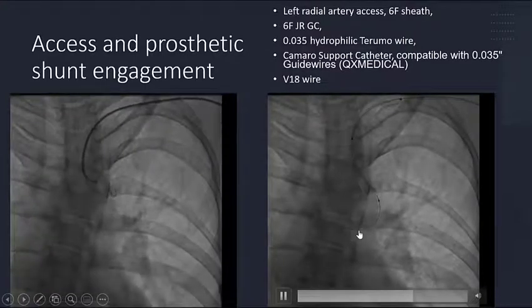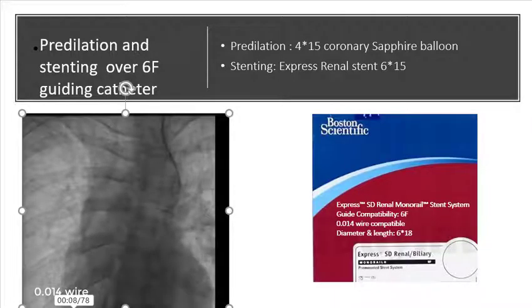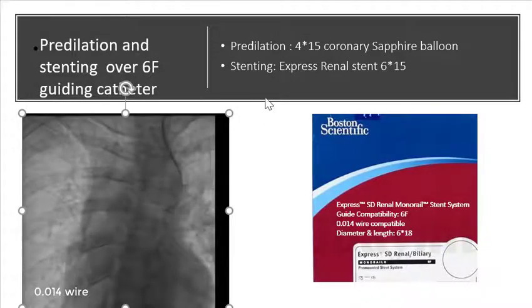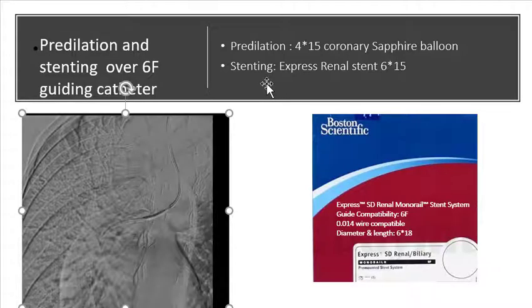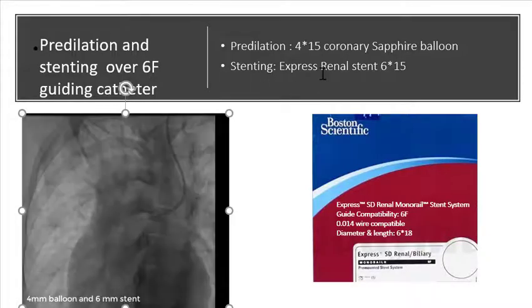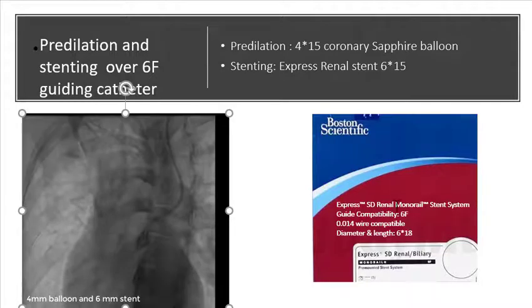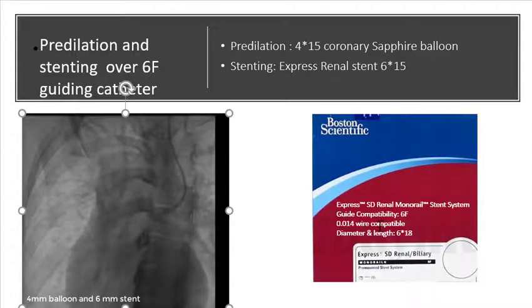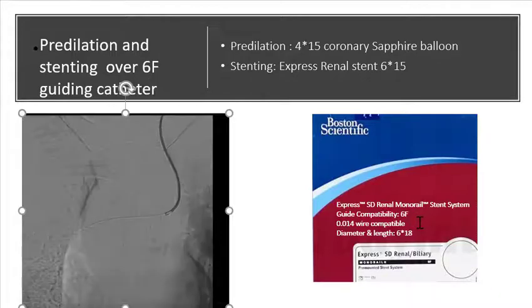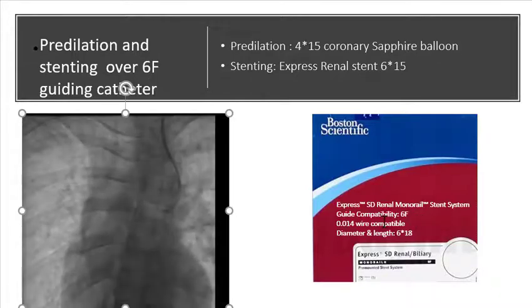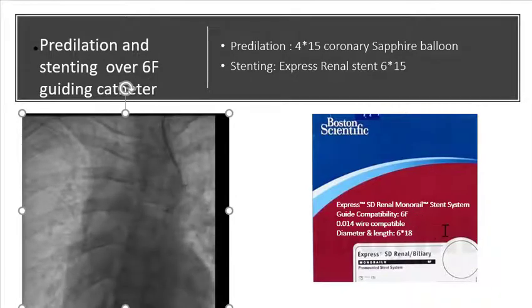This is the V18 wire. Afterward, predilation was done with a 4 mm coronary balloon. After predilation, stenting was done with an Express renal stent. Express renal is a monorail stent system. It is compatible with a 6 French guiding catheter, and it is also compatible with a 0.014 wire.